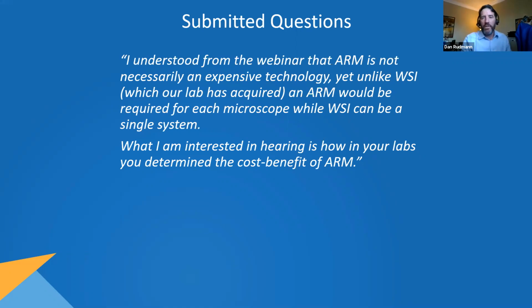And I think that's got some value that's different than the value you get from a WSI approach. So again, I don't think they're conflicting with each other. There are some limitations based on financials and other things for sure, and I totally agree that it is a huge infrastructure to build to do it right for WSI. But I think they're complementary, and I think that the ARM is possibly for a lot of pathologists a great transition into digital pathology.